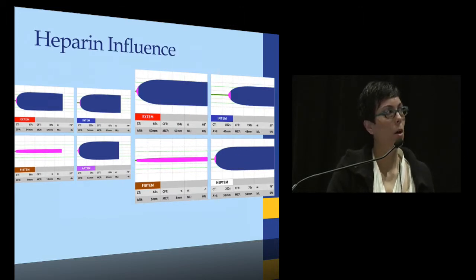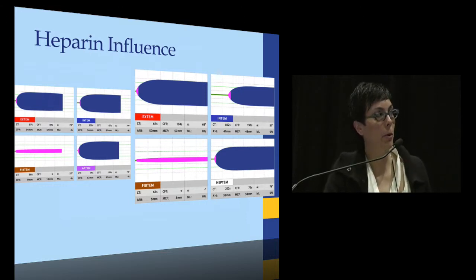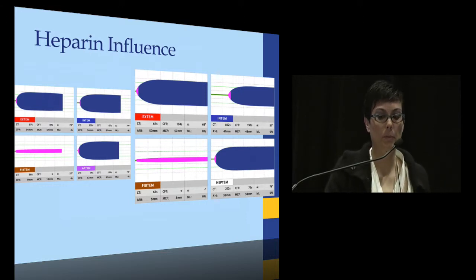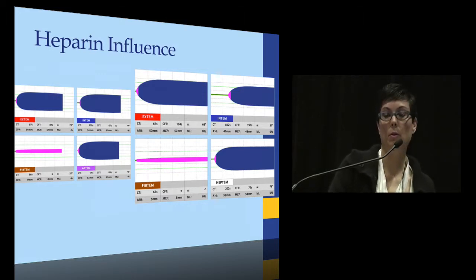And now here's where a lot of the cardiac groups use ROTEM for their practices, for the influence of heparin. So the way you do the HEPTEM, as I mentioned, the first track is you do the INTEM, and then you add heparinase. So you basically neutralize the effects of the heparin, and you end up seeing that it's now normal. Okay, so if it wasn't, you know that there's a heparin influence in that portion of it.